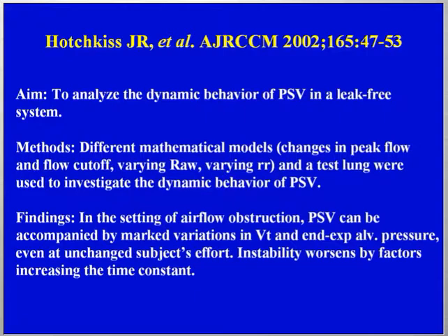They tested the model on a bench with a test lung, and what they observed was that in the setting of airway obstruction, pressure support ventilation is accompanied by marked variations in tidal volume and end-expiratory alveolar pressure, even if the patient's efforts don't change. They concluded that instability worsens with factors increasing the time constant.